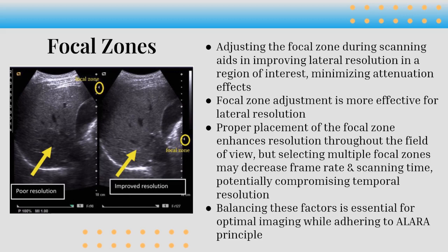Proper placement of the focal zone enhances resolution throughout the field of view, but selecting multiple focal zones may decrease the frame rate and scanning time, potentially compromising temporal resolution. Balancing these factors is essential for optimal imaging while adhering to the ALARA principle.